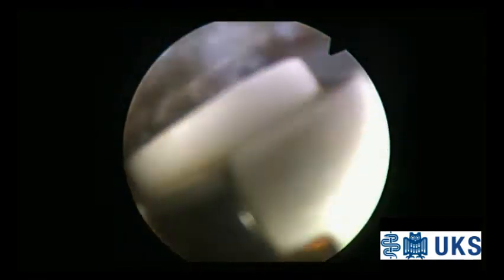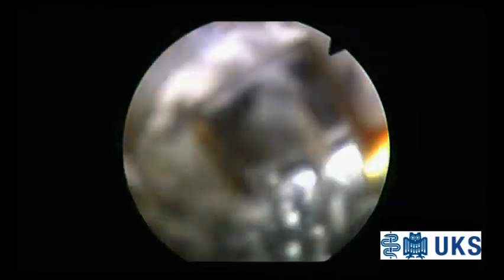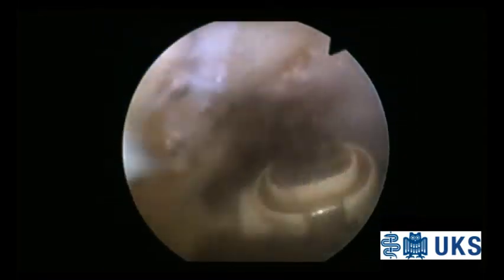Under general or spinal anesthesia, the patient is positioned supine using a leg holder and an unsterile tourniquet.